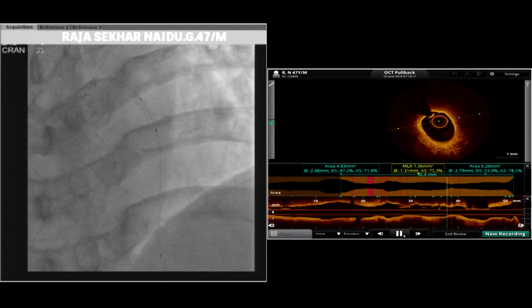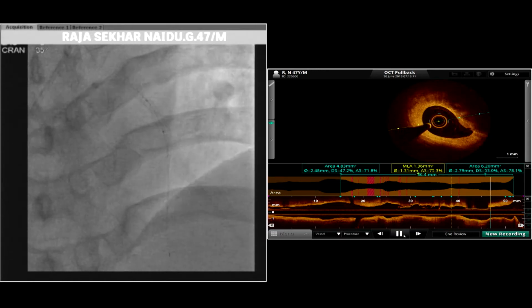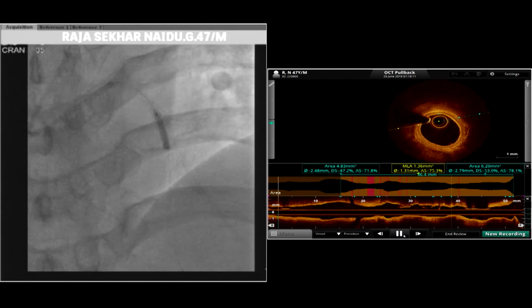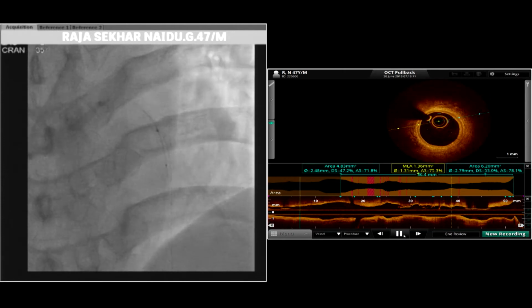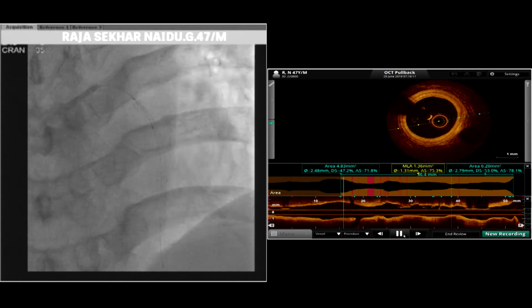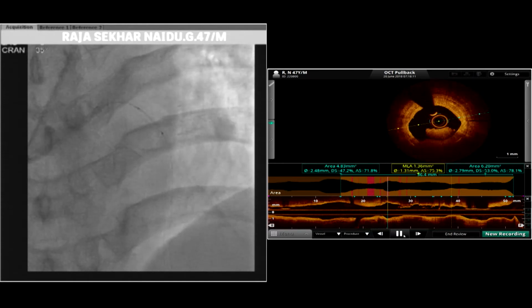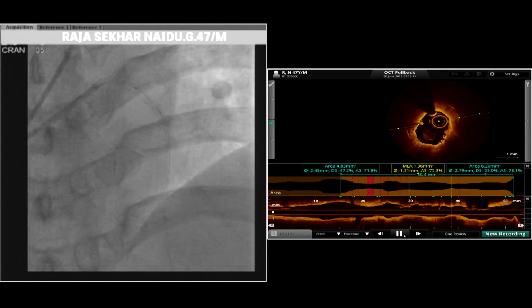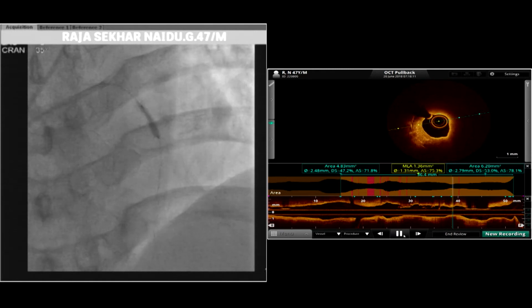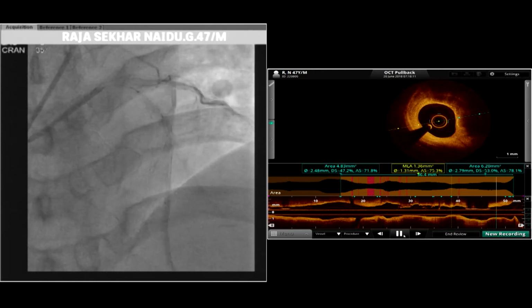Holding the balloon, it just kicks out of the stent. So this is hard fibrotic tissue. You have to crack this to get in a stent for full deployment. And of course, next we went in very slowly, with slow inflations, and we could break the tissue. We are not doing one more run because of the fear of dislodging whatever white thrombi there. So we are going to go ahead with a 3x38 stent straight from the ostium of the LAD, taking care to avoid that large ramus.